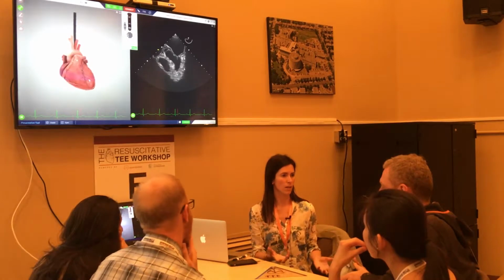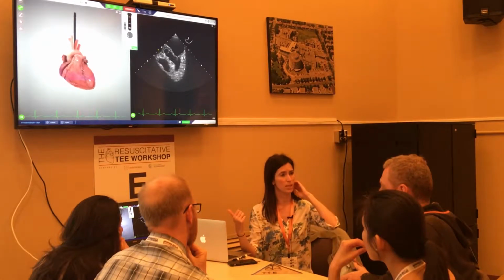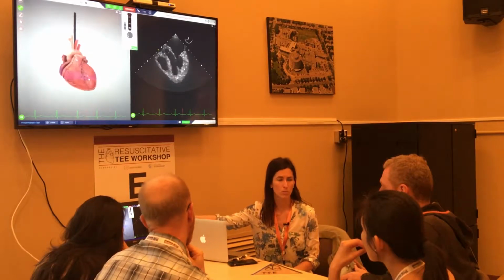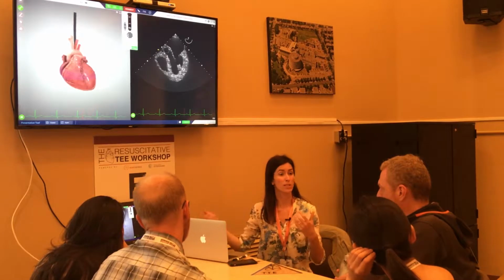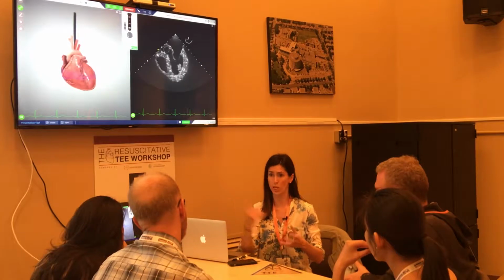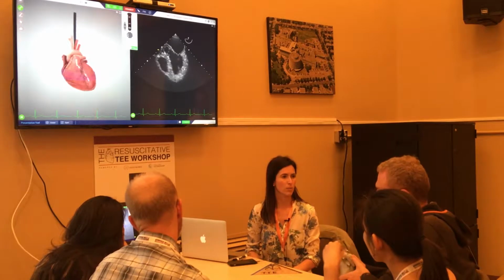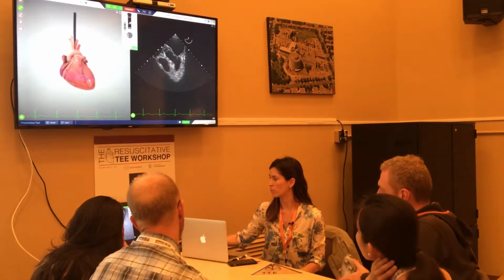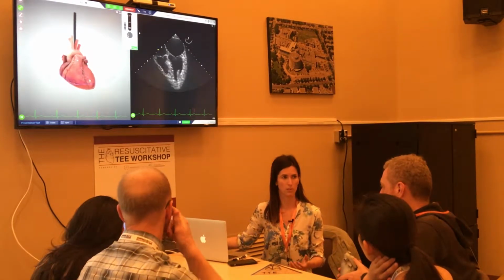You can get an apical 5-chamber view on transthoracic echo that you won't be able to get at this position on TEE. So know that when you're seeing that aortic root, you have to advance the probe a little bit further. And this can be important if, for instance, you're in a resuscitation, they're doing CPR, and you have 10 seconds that you need to get that 4-chamber view. What would you do if you saw this and you wanted to get a better view? Advance the probe. And just by advancing the probe, that aortic root's going to go away, and now you're seeing your 4-chamber with the tricuspid view.